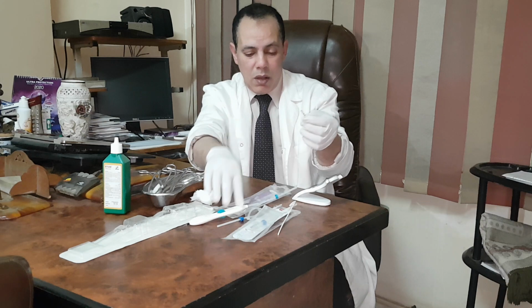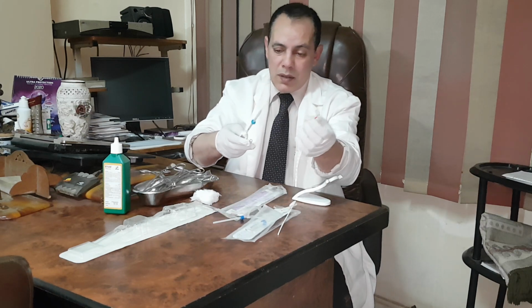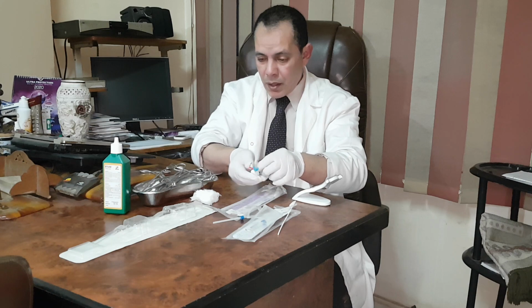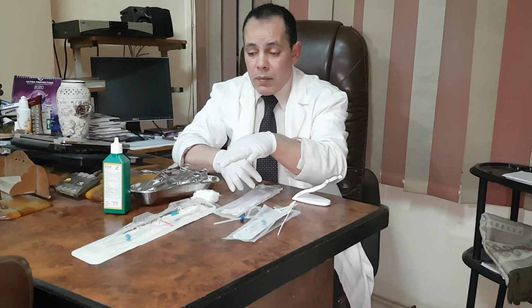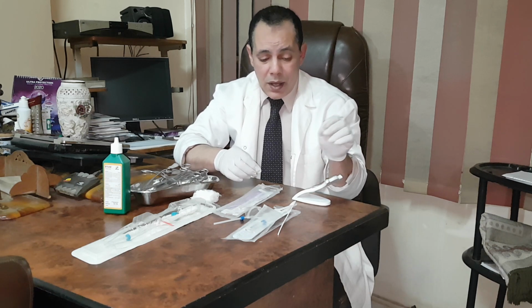This is the IUD, how it locks. And this system is called the Mirena system, or levonorgestrel releasing intrauterine system. Of course, it is suitable for patients who have heavy menstruation with the copper IUD. Mirena could be a good choice for heavy menstruation because it makes the menstruation small in amount.